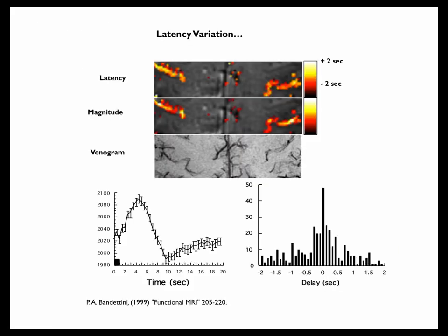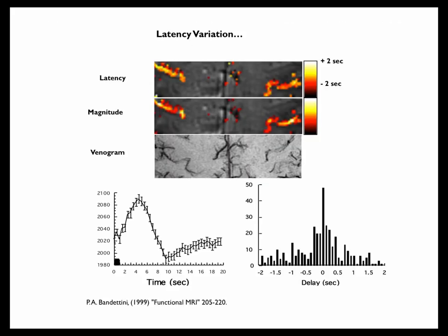Okay. Another way of thinking about temporal resolution, the way people typically think of it with fMRI or brain mapping, is how well you can resolve one part of the brain turning on versus another part of the brain. That's what people really think about when they think of temporal resolution. And with fMRI, unfortunately, that is a mess, because of the fact that you have your hemodynamic plumbing that drains through. This kind of illustrates that point.